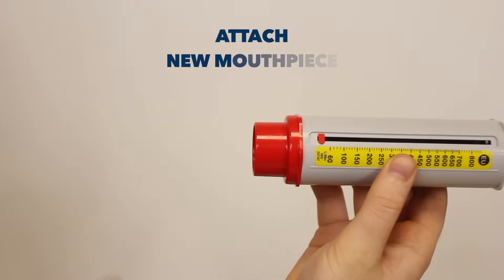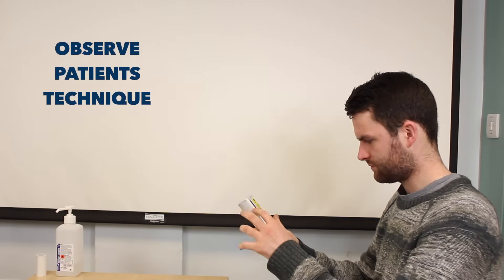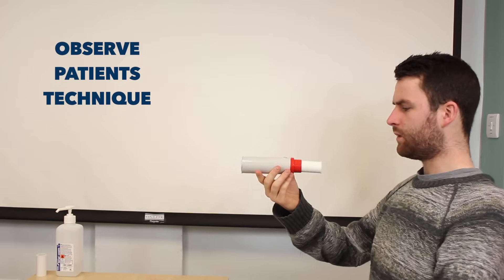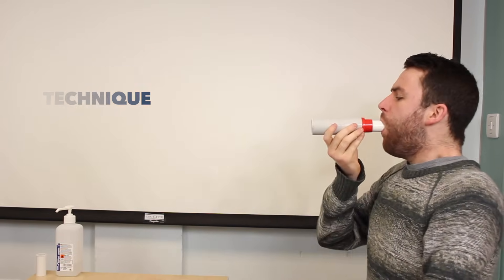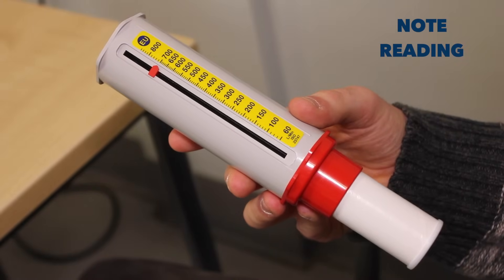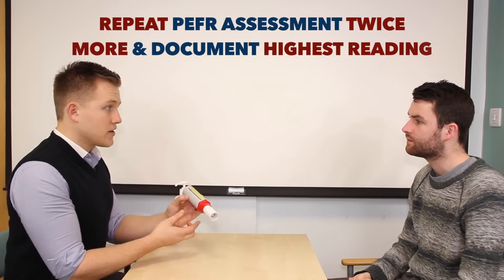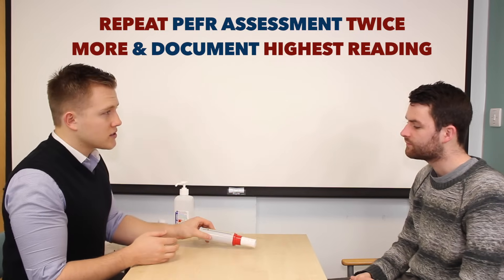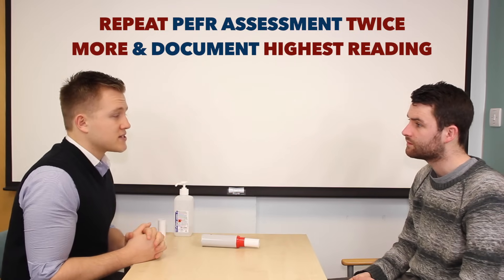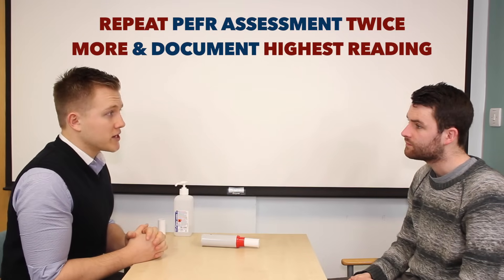It's now time for you to have a go. That's a really good score of 700. To finish, we just need to take another two readings. We'll take the best of all three readings and record it in your peak flow diary.